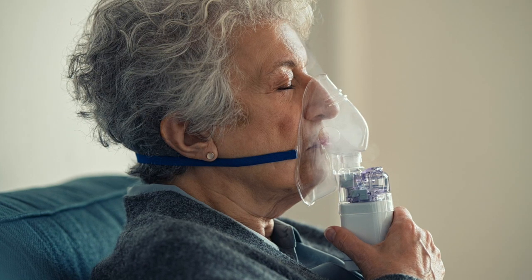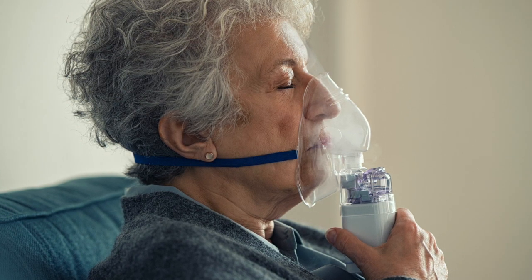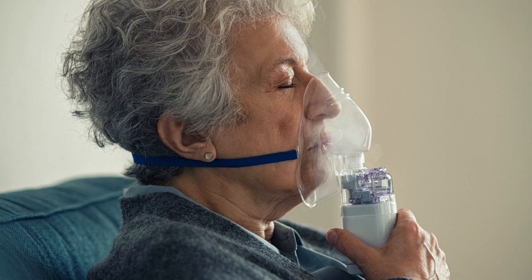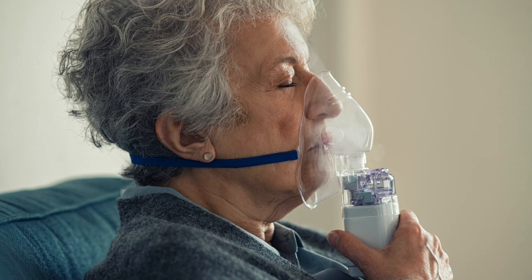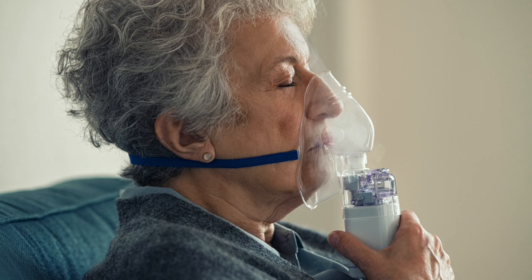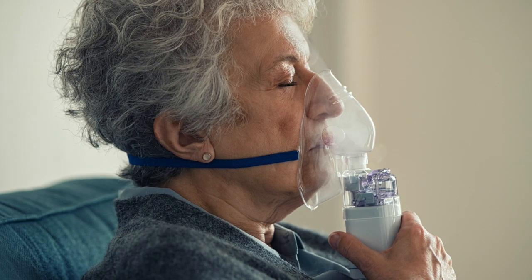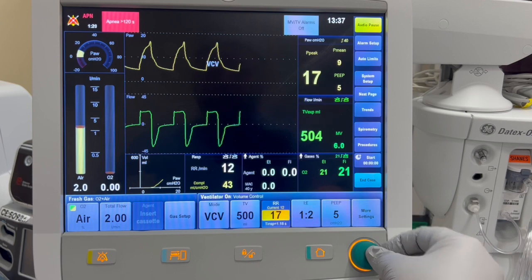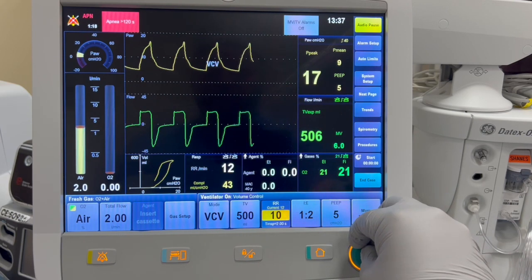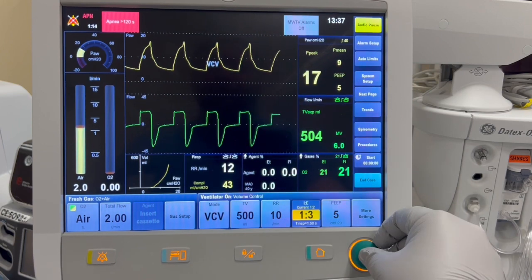Finally, it's best to provide a tailored anesthetic to these patients and understand the patient's baseline oxygen and CO2 levels. Higher FiO2 levels can often be harmful to this population, so during the maintenance phase, it's best to keep FiO2 levels as low as possible unless otherwise contraindicated. Here, you can see me making a couple adjustments, including the respiratory rate located here and the I:E ratio located here.